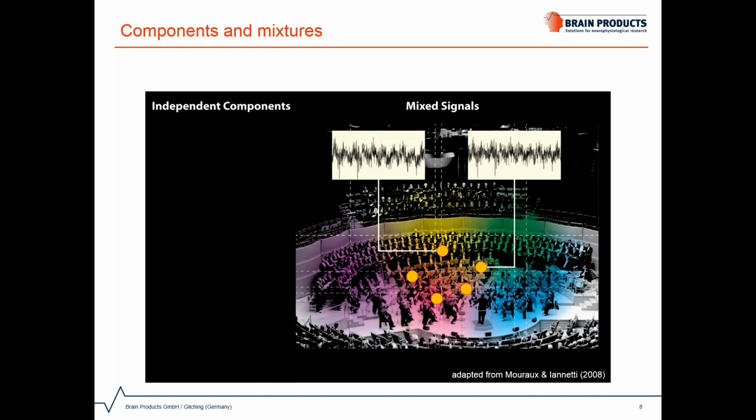What we want to do is to unmix the signal in order to extract the key players and reduce the noise. Independent component analysis offers this opportunity. It can unmix the signal mixture stemming from different independent sources. If an ICA is meant to succeed at this unmixing procedure, several theoretical assumptions need to be met.